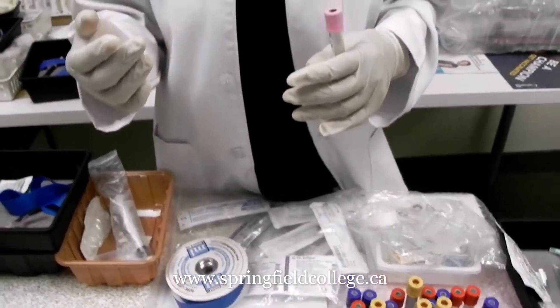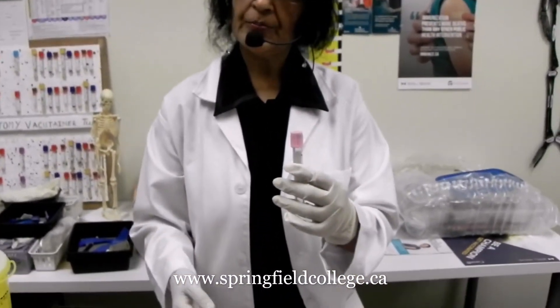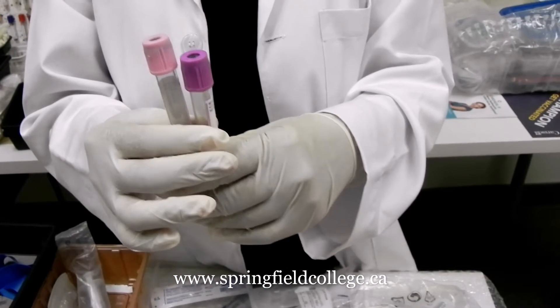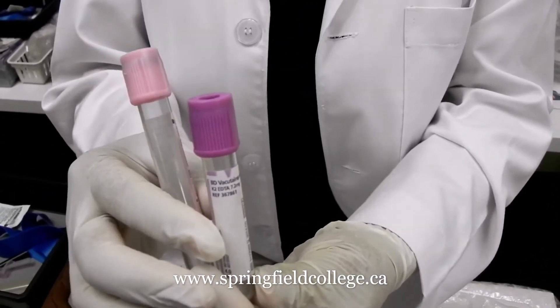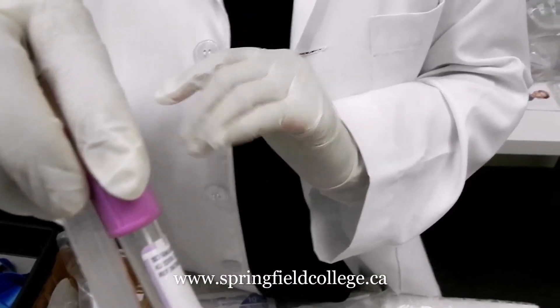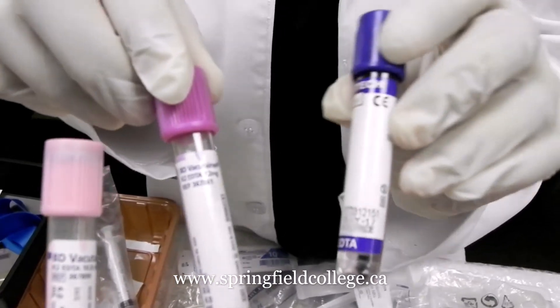After that we have the EDTA tubes. EDTA comes in different types. One is the pink top tube. Another is the most commonly known magenta or purple tube, also known as the lavender tube. Both are EDTA tubes. There is also one more tube that looks like the royal blue tube but also contains EDTA — it is a K3 EDTA tube.